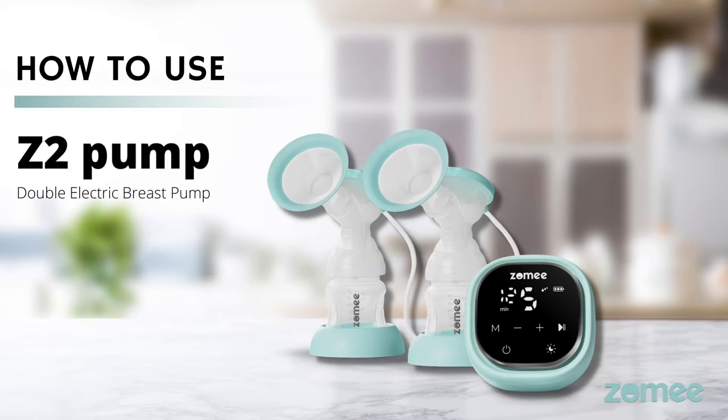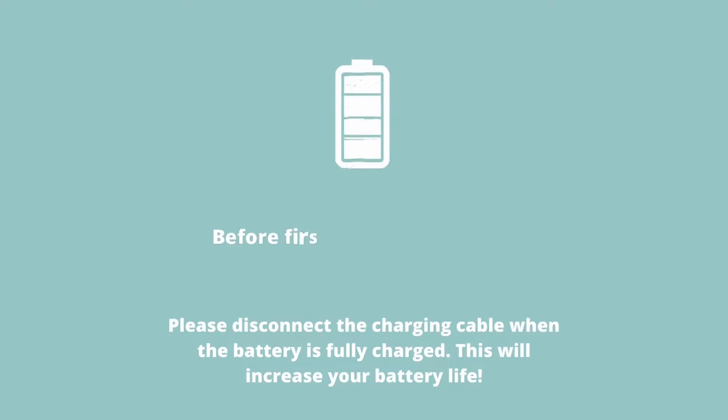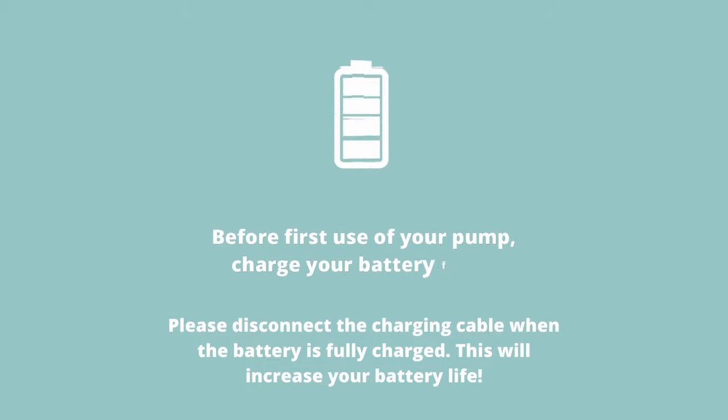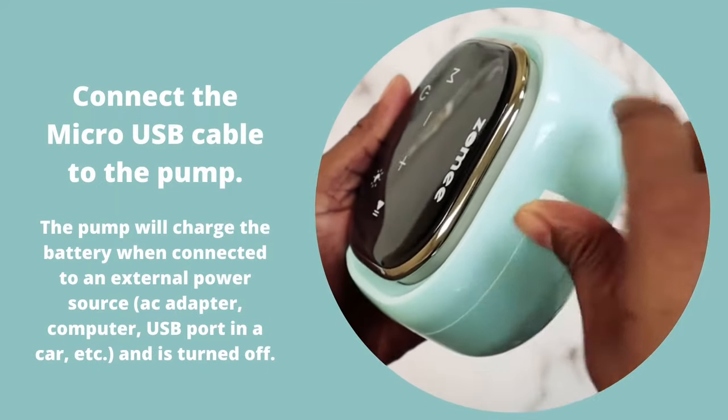How to use your Z2 Pump Double Electric Breast Pump. Before first use of your pump, charge your battery fully. Please disconnect the charging cable when the battery is fully charged, as this will increase your battery life. Connect the micro USB cable to the pump.